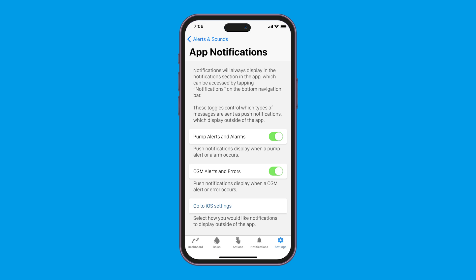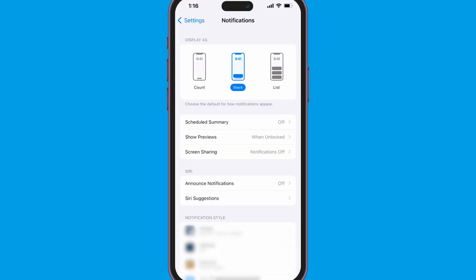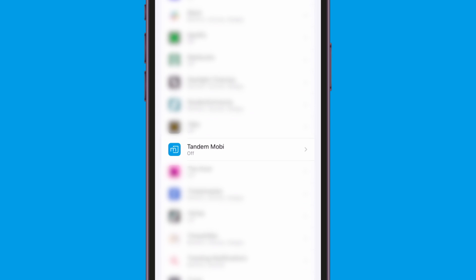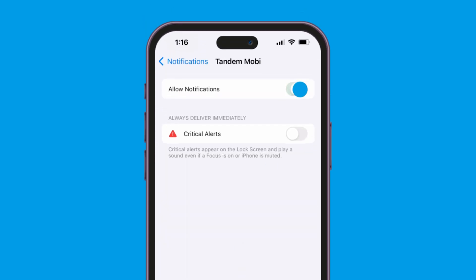Make sure your notification preferences are enabled and that your smartphone will allow notifications from outside of the app. To do this, go to settings, then notifications, then toggle allow notifications to the on position.